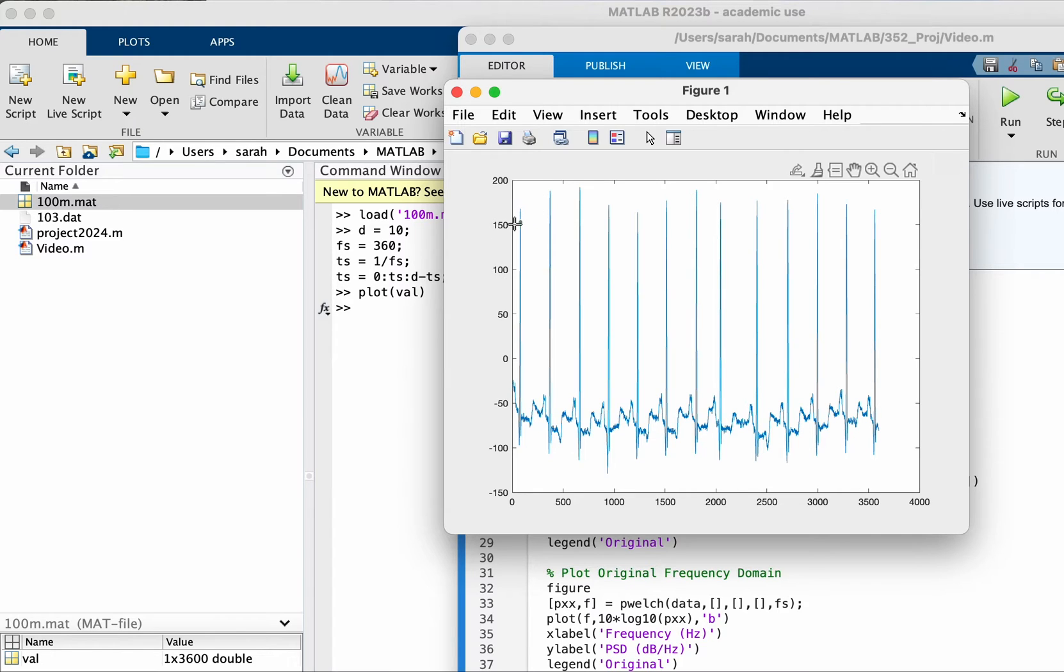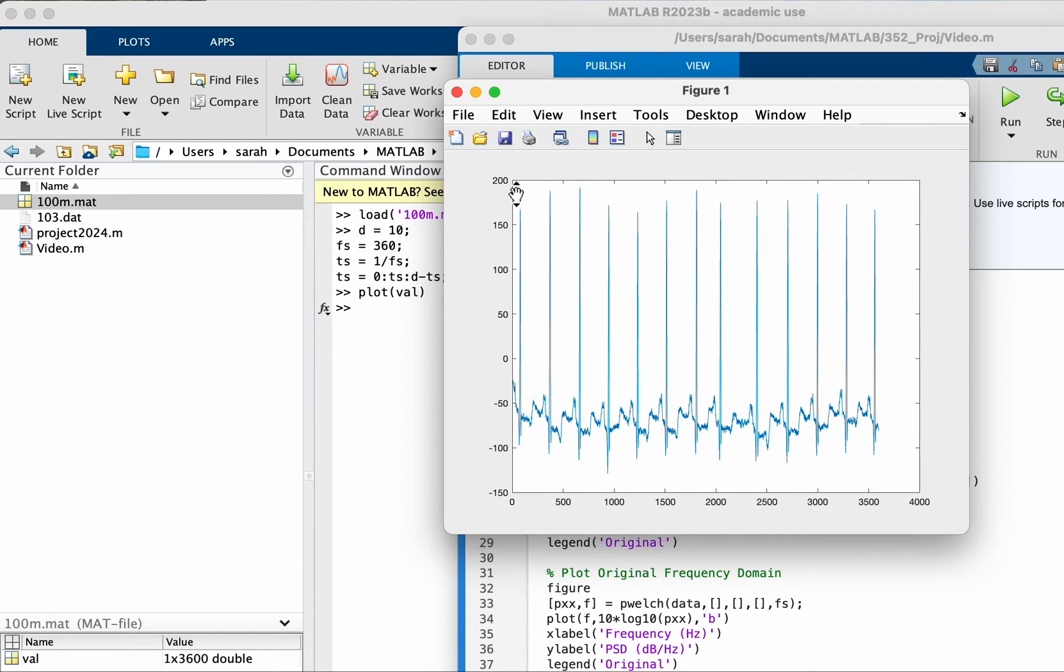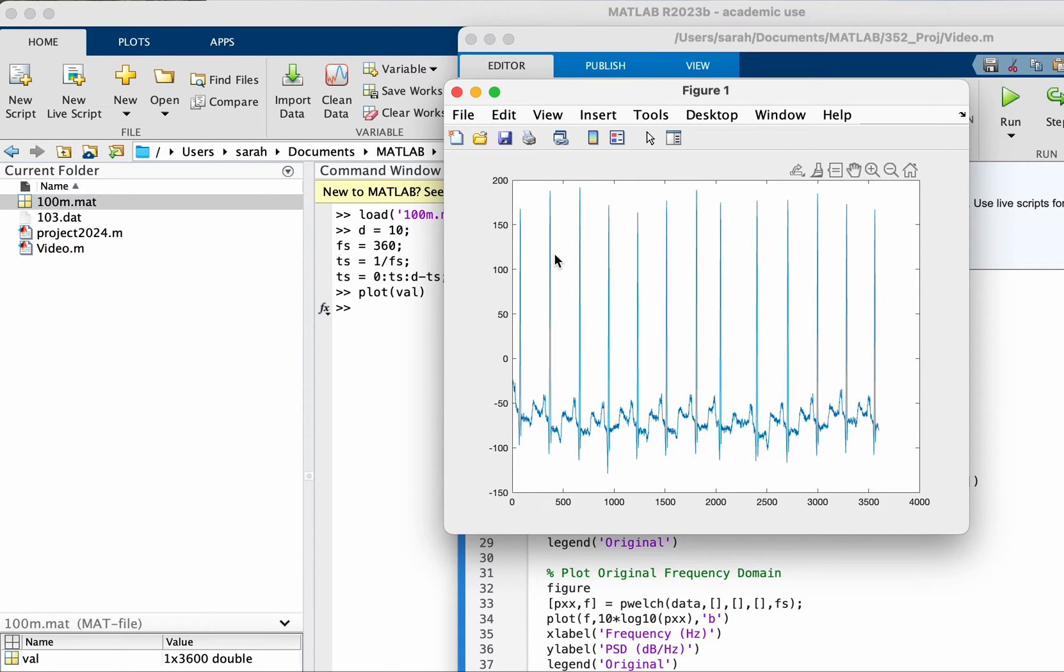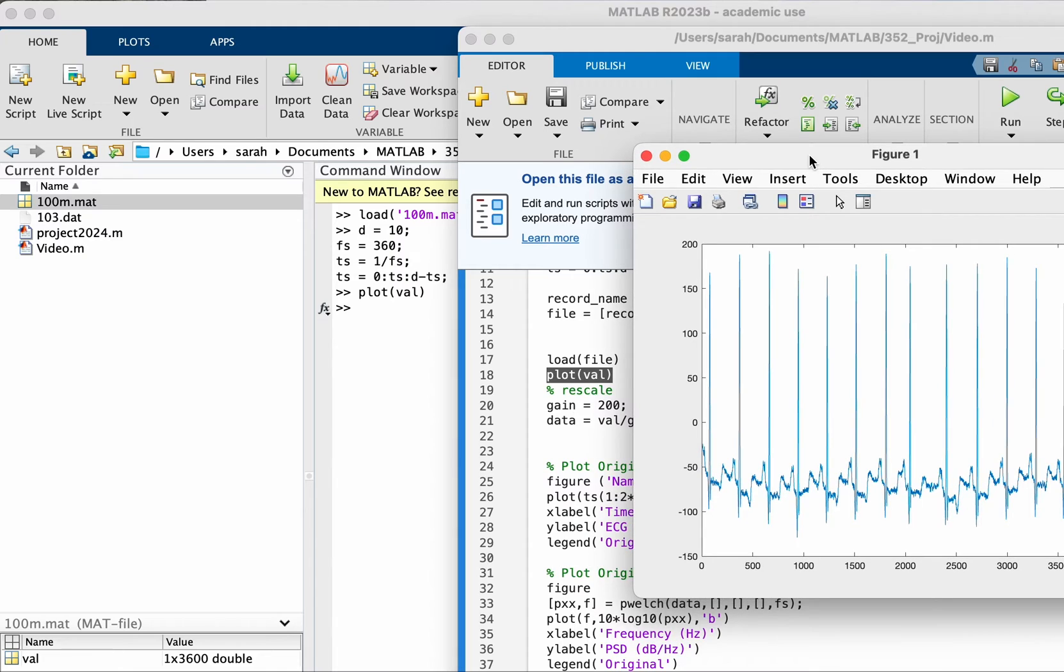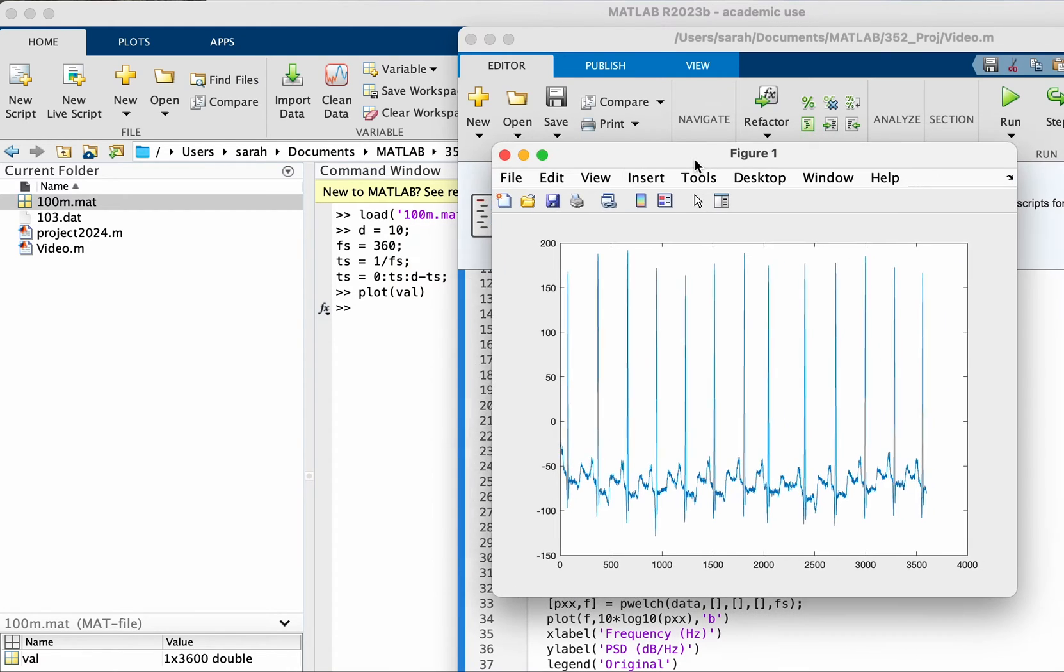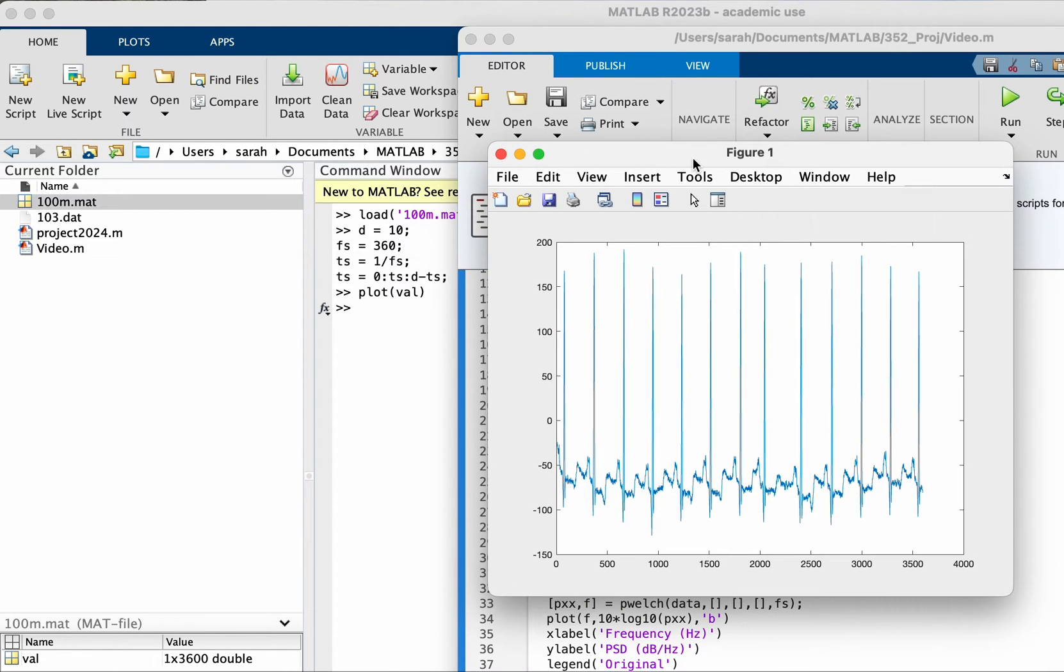You can see that the scale is from minus 100 to up to 200, which is actually scaled up. So I got this signal from a database in PhysioNet. Usually when you download any data it will tell you if there's a gain that was applied to the signal.